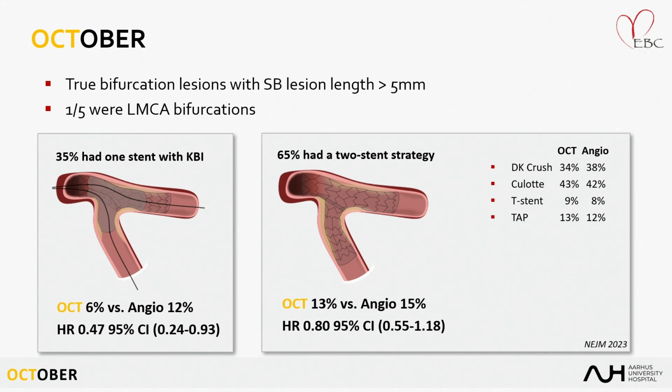But two stent techniques, we pushed for that at the time where we also got COVID. And to do complex two stent techniques at the time where you're told by management and experts to do very short procedures and get the patients out of the cath lab was probably not a very good idea, and we could clearly see that in the quality of OCT guiding at the time.